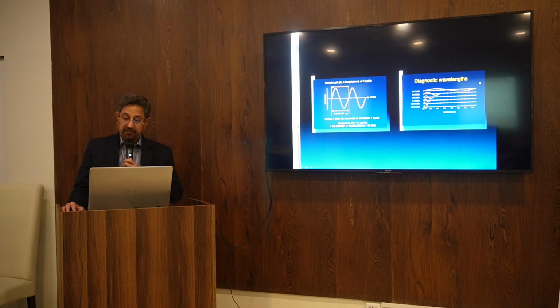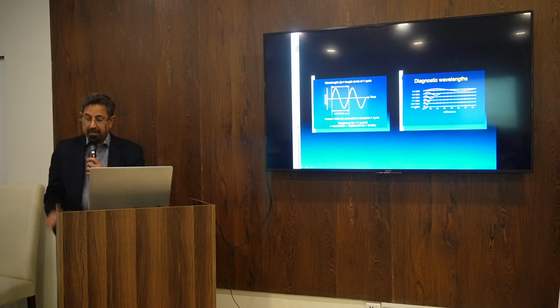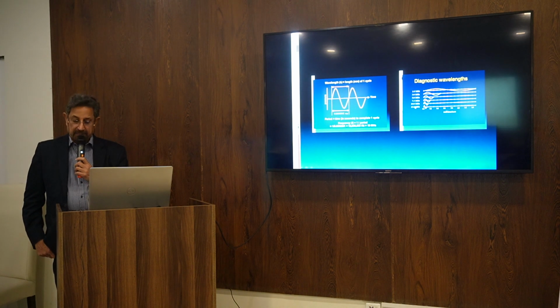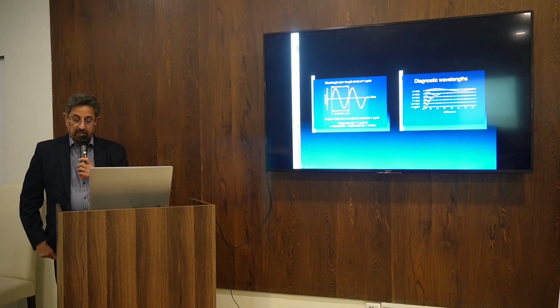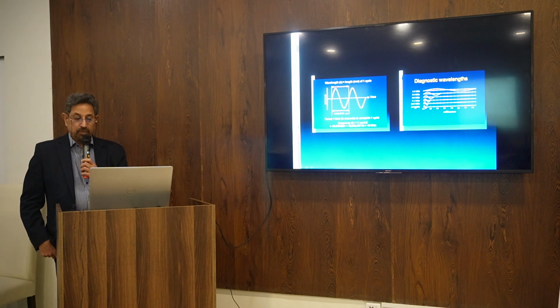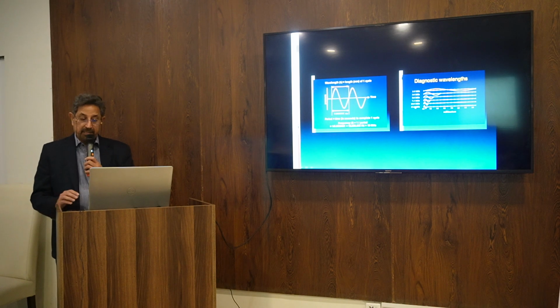A very important fact is that for diagnostic ultrasound we use from 1 megahertz to 15 megahertz. Even now, for corneal ultrasound, people are using 30 or 40 megahertz, very high frequencies. But most commonly in radiology, in medical imaging, in peripheral vascular study, we use 1 to 15 megahertz.